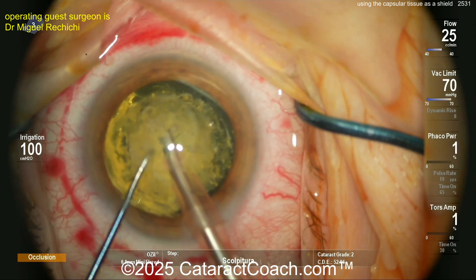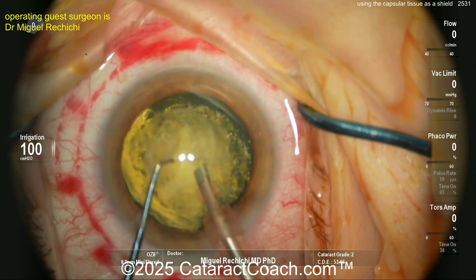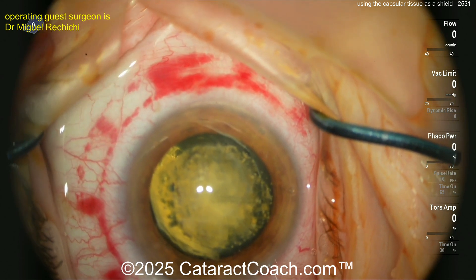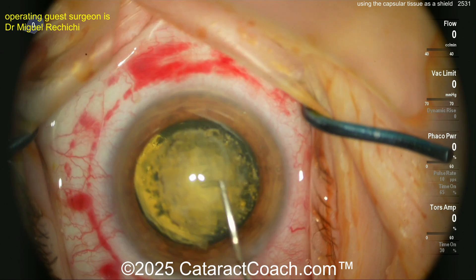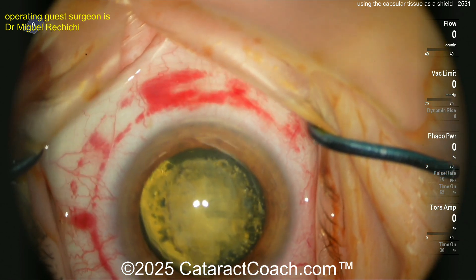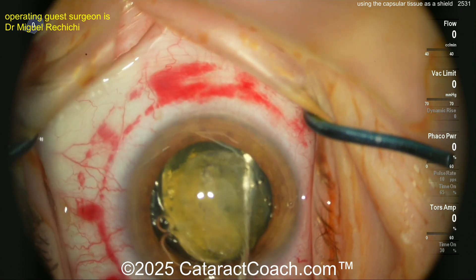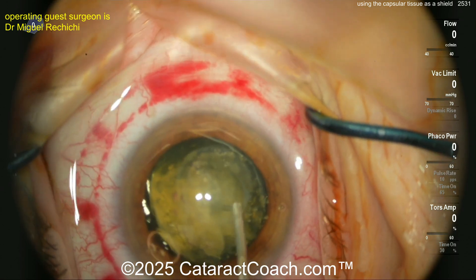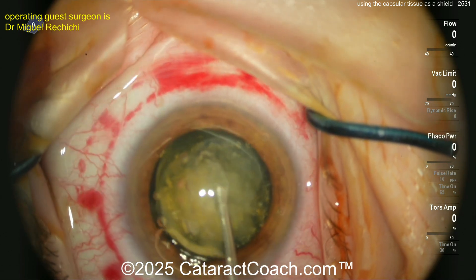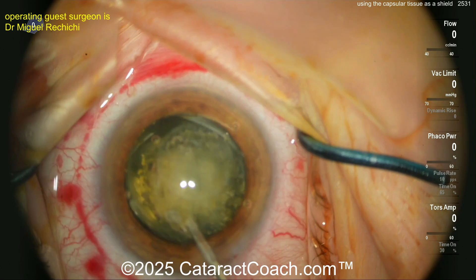The surgeon is now using the phaco probe to take out the nucleus — still needs to chop it up a little bit. This part of the video has been sped up to 2x normal speed. More viscoelastic is going inside the eye, getting that nucleus tilted or rocked up. For routine cases, I do not find the femtosecond laser to be a big benefit.